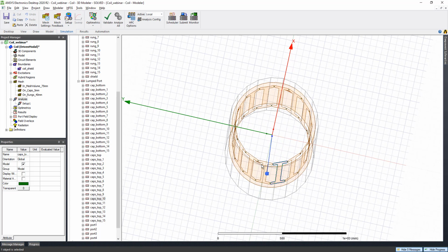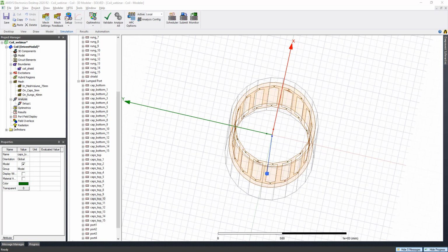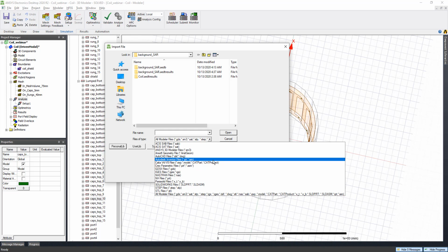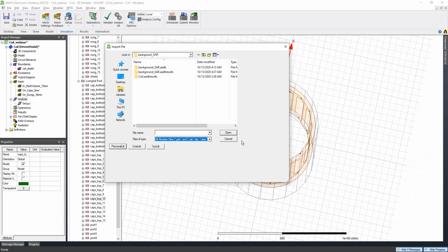Okay, so first of all, HFSS allows you to import many different types of geometries. Here you can see we can import CAD files, Parasolid files, SolidWorks files, STEP files, etc. If you create your model in other tools, you are always welcome to import your design here.